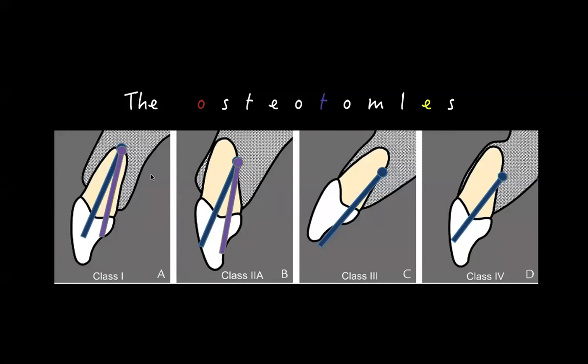And that's why, going back to the very beginning of the lecture where I said, when you pick an implant system, you better pick a system that gives you a really ease of use when it comes down to the restorative part, whether you're just a surgeon, whether you're a surgeon and a restorative guy. In any event, you need to create that for yourself.